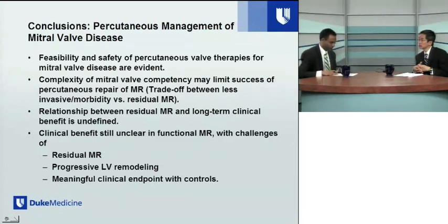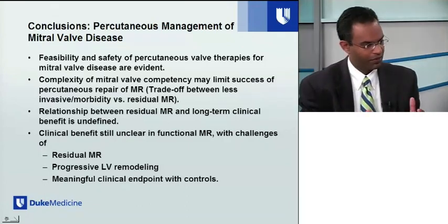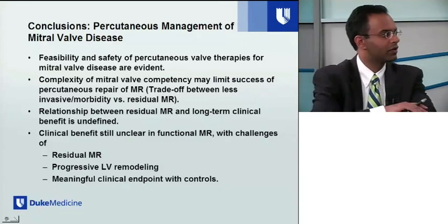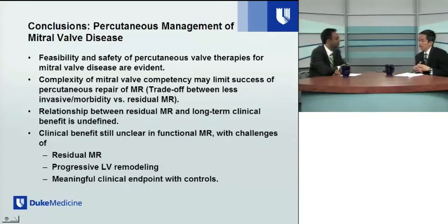So final question here. We've heard a lot about the trial data. Is there any mechanism right now for any type of compassionate use for any of these? The eValve device is available in a continued access registry until we learn whether this device will be approved commercially. So there is an ongoing registry on a very limited basis available to the operators and the sites who participated in EVEREST 2.